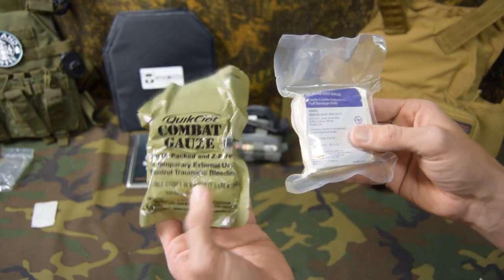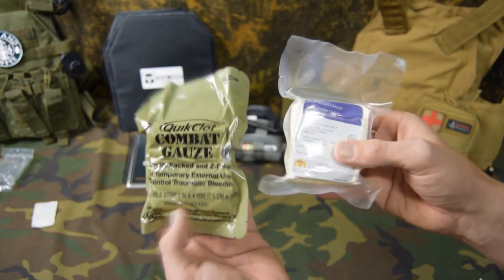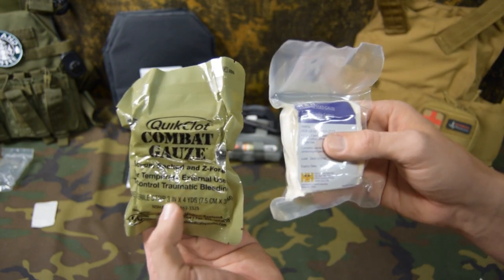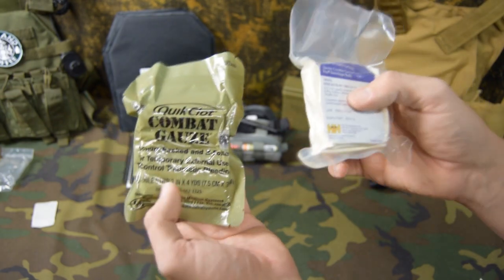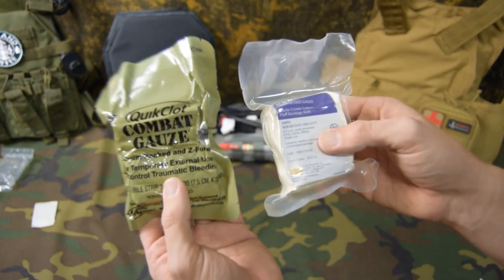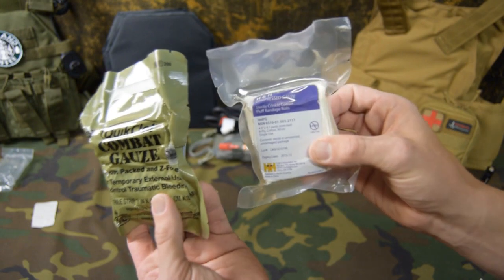This is the hemostatic gauze we were talking about earlier in the video — this has a hemostatic agent bound to it, this does not. These are both four yards, so you get the same amount of material in each package. But this does have a hemostatic agent, which basically takes the water out of the blood, makes it thicker, which helps the clotting process, and it also has the gauze. So these are both gauze, but one has a hemostatic agent. This is going to be more expensive than the H&H gauze.